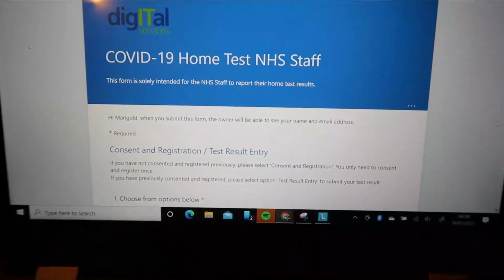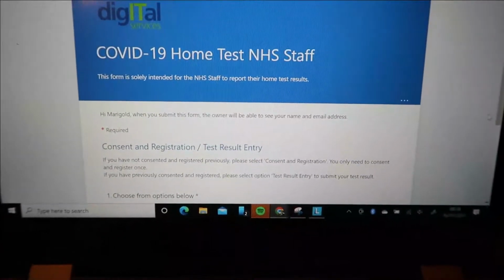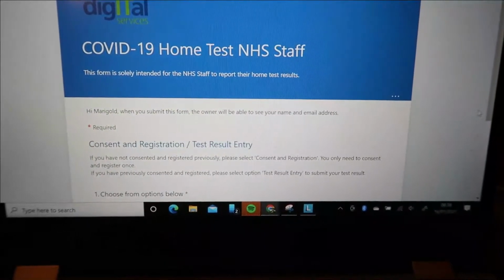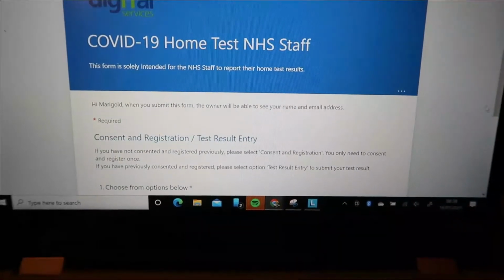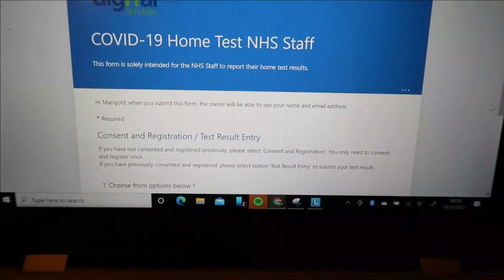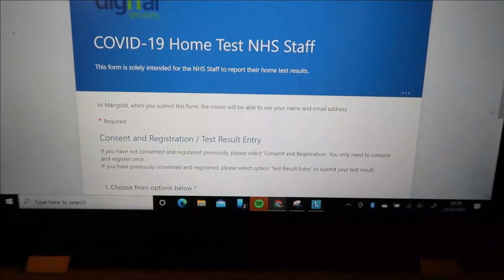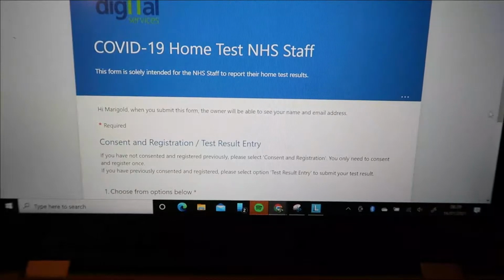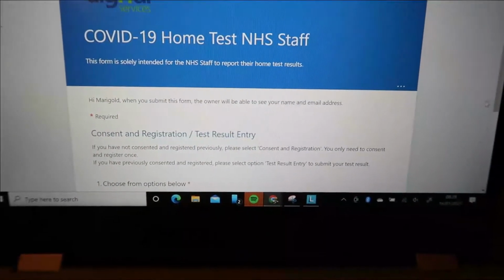After you get your result, you need to log it online, and this is the website on the link that we were given, so that it will be monitored. They won't just give you this home test for nothing. They need to monitor whether we are actively using it, because it also helps in preventing the spread of infection in the whole trust. So that's basically the reason why we need to log it.